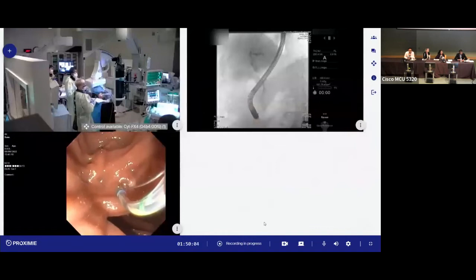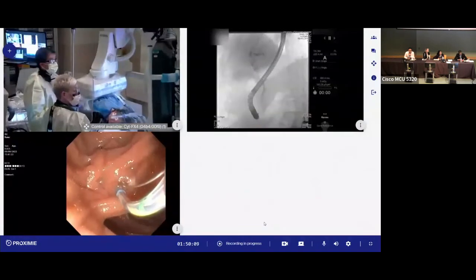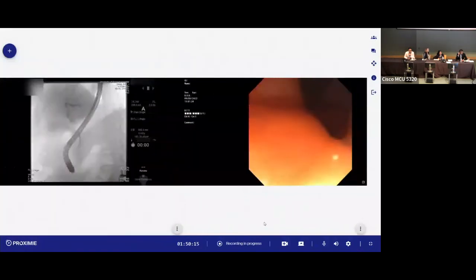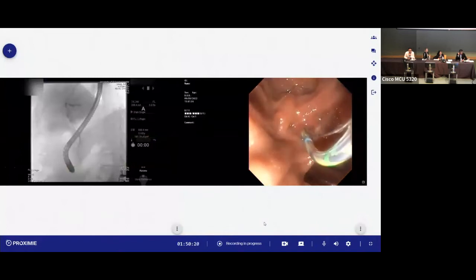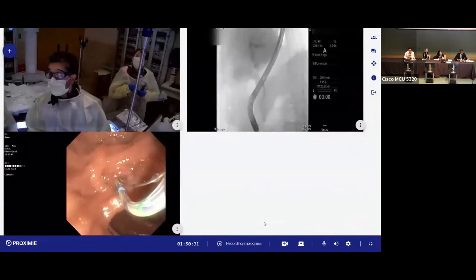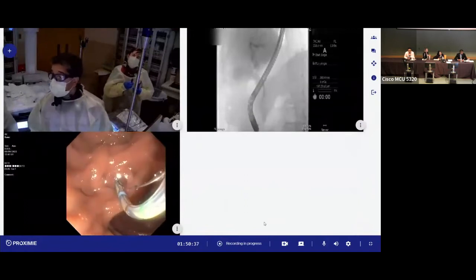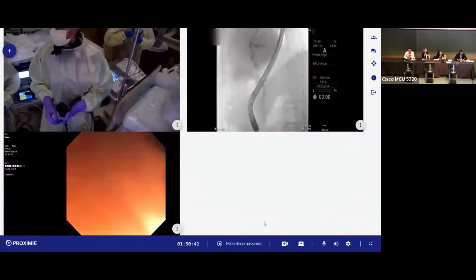And so what we're going to do, we still need the endo view. We can see you, but not your hand. Raj, we can't see your hand. Can you hold on just endo for a second and then step back? Oh, okay. If you go back to that view you were just at, I bet you'll see it. Yeah, but we wanted to see a quad image. So we want to see endo, fluoro. Now we see your face. Very good. That's all right. It might just have been cut, the previous view, but maybe zooming in on your hands. There you go. That'd be much better. Oh, there we go.